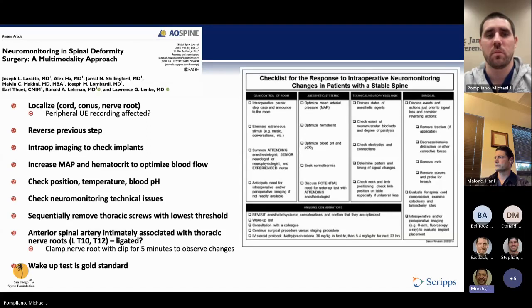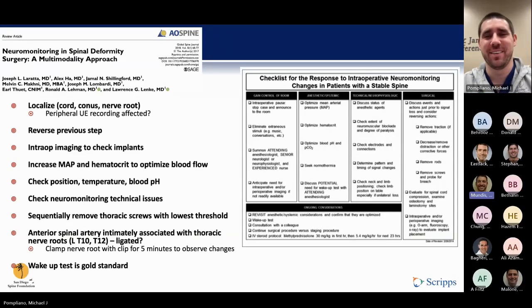If you're at a new place doing a high risk case, then you have to take the lead as the surgeon and tell them what you want. Because a lot of times when the neurophysiologist tells the anesthesiologist what they want, the anesthesiologist is like, no way, or they'll put up a fight, or say, you're not running anesthesia, it's my case. And then once they knock someone out, you have a 15, 20-minute delay to get things to reverse. So clearly communicating before the case is really important.